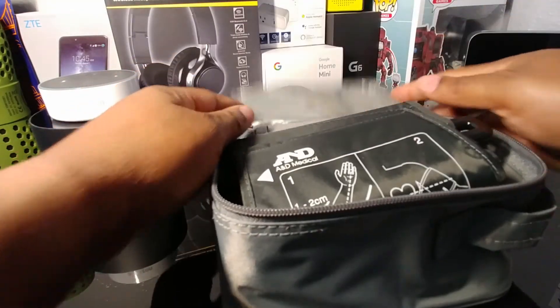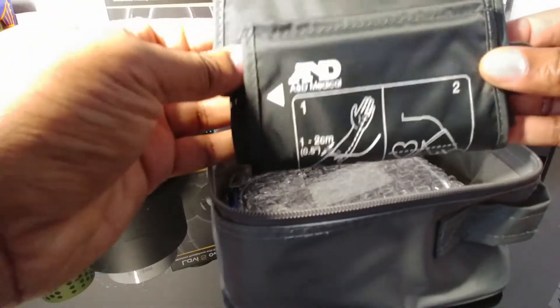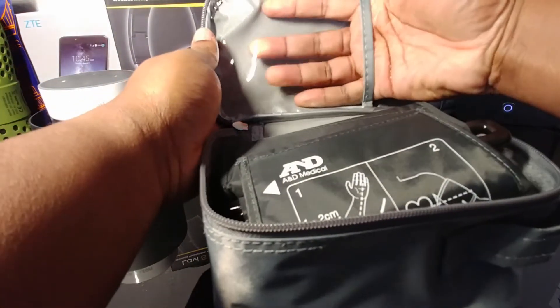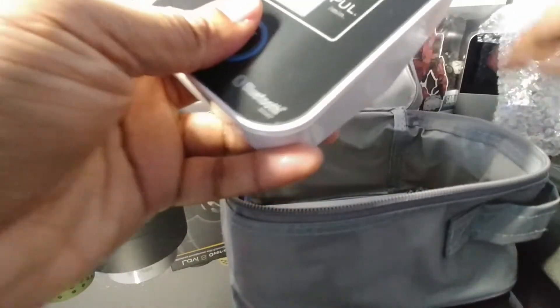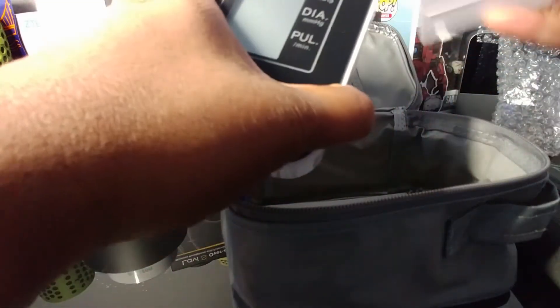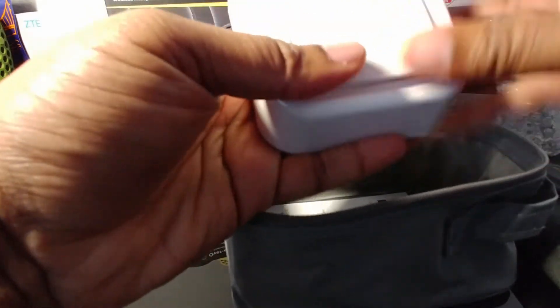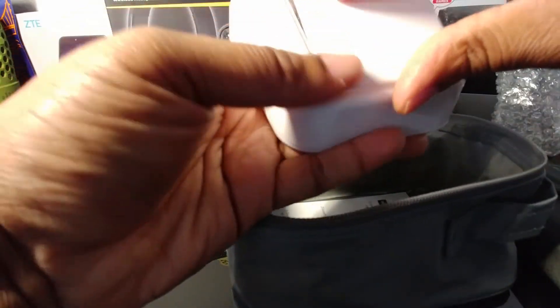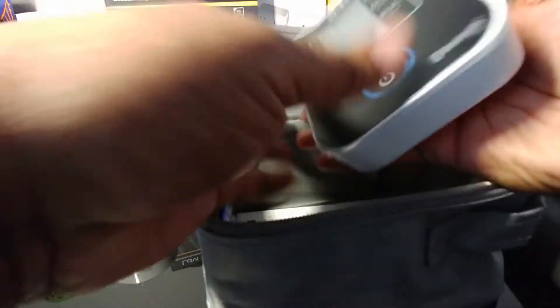You're first greeted with the arm cuff that the unit will use to check your blood pressure. It's also nice to have this little pouch in the carry bag. Then we have the unit itself — and there's a battery door, so it looks like this takes four double-A batteries.